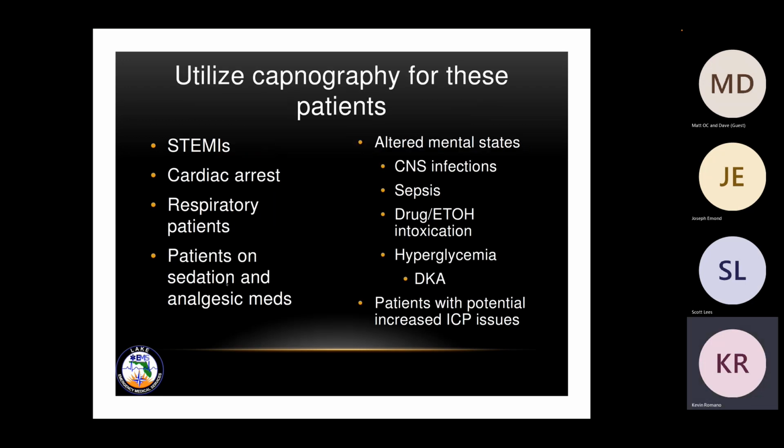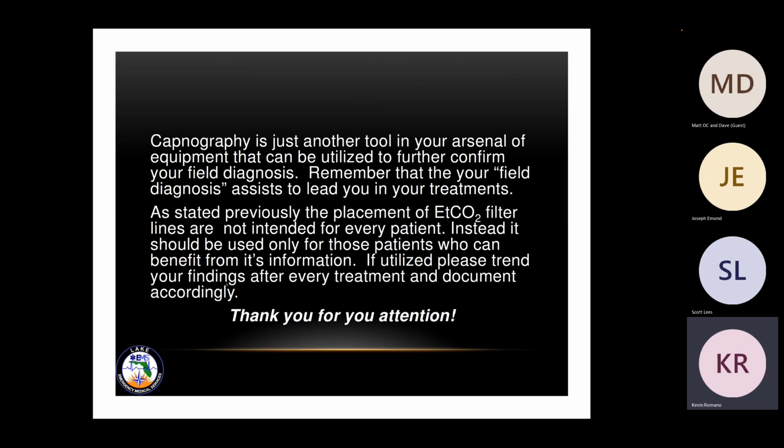But we want to utilize them for STEMIs, cardiac arrest, respiratory patients on sedation or analgesic meds, altered level of consciousness or mental states like CNS infection, sepsis, drug or ETOH intoxication, hyperglycemia with DKA, and patients with the potential for increased ICP. Remember that it's just another tool in your arsenal. Utilize it. It's there to help you.